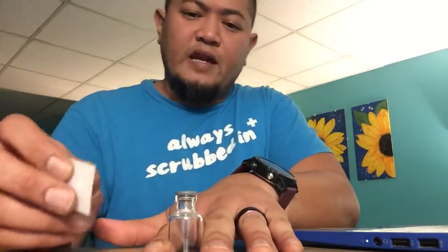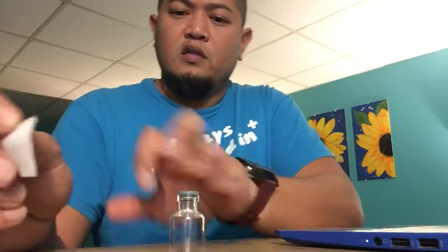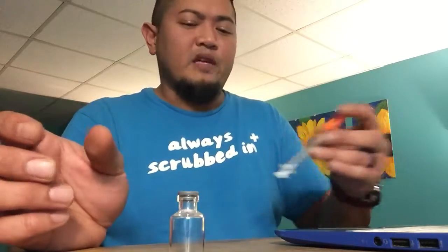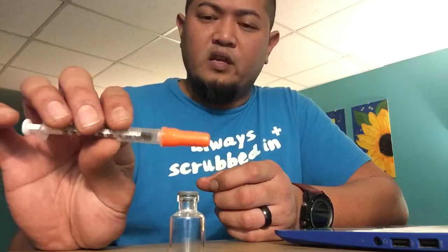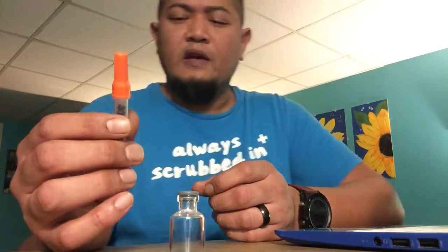Hold it firmly on a flat surface. Scrub the top of the vial. After scrubbing the vial, you are going to grab your needle with the VAD. For training purposes, this is just a regular insulin needle. I'm just going to pretend that it is a syringe with a VAD.